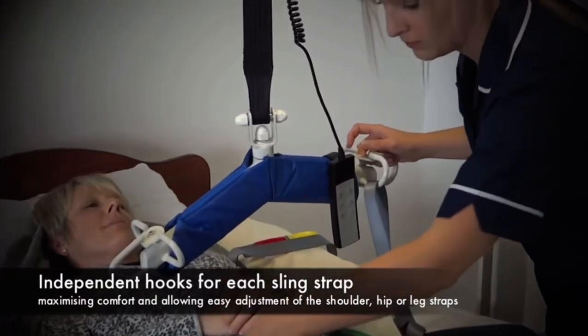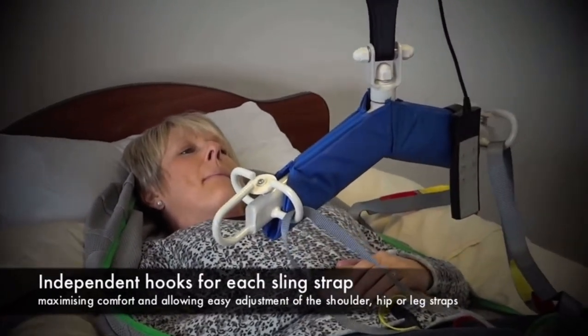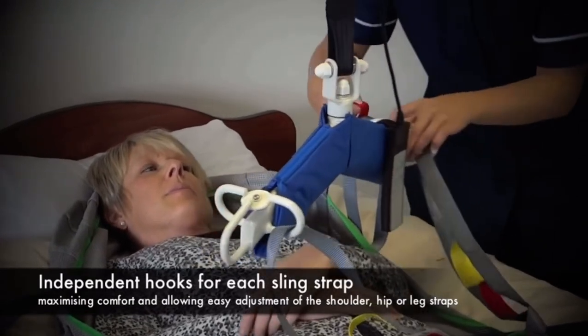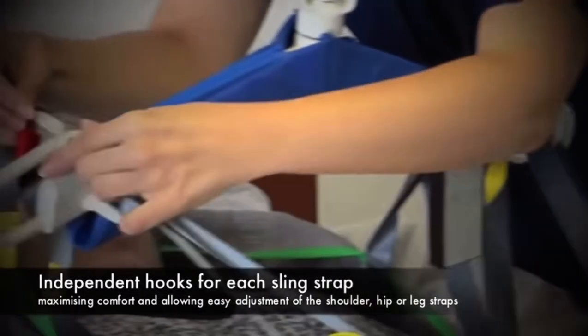When hoisting the client to get them into a traditional seated position, the loop positions would be long on the legs and short on the shoulders. This allows a nice 90-degree sitting position during transfer.